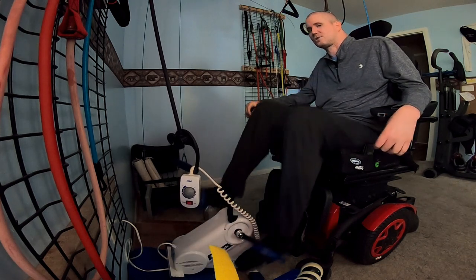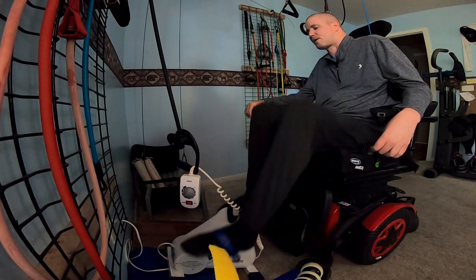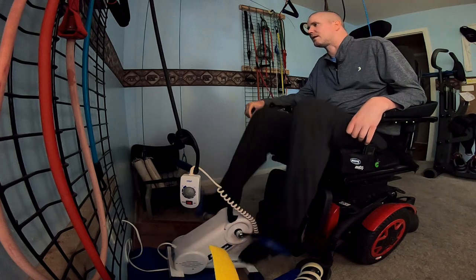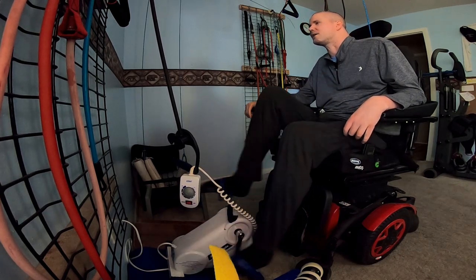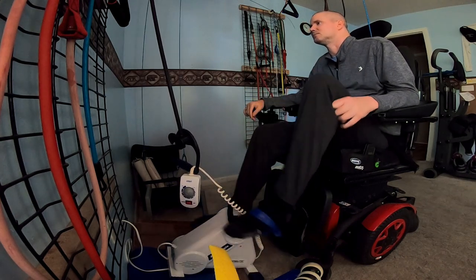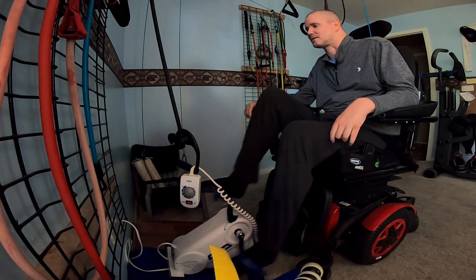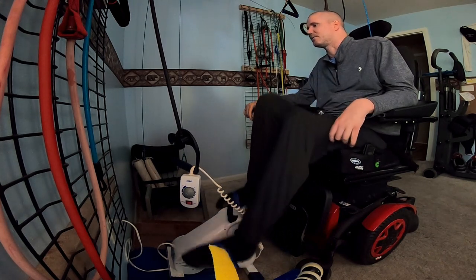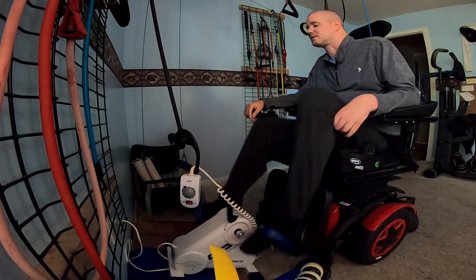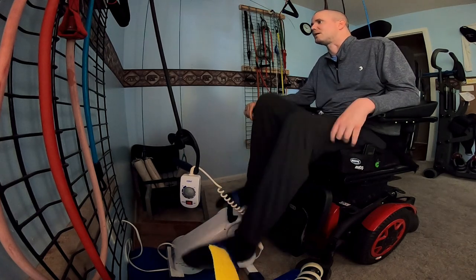And ultimately it's your choice if you want to do this on a regular basis or not. Sitting in a wheelchair all day with your legs just in one position, not moving — it sucks. But it's the reality of a lot of people in wheelchairs. But if you could get something like this, I would think it would make a big difference in your life.